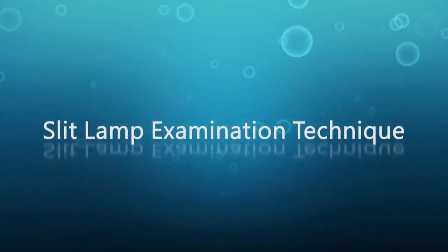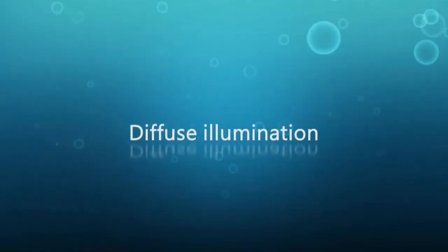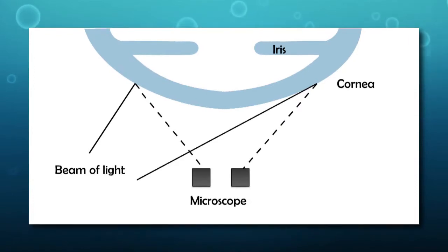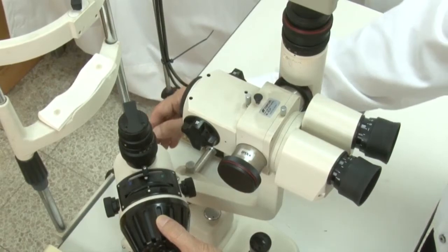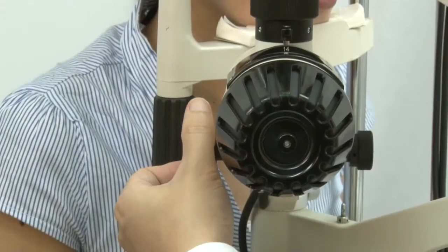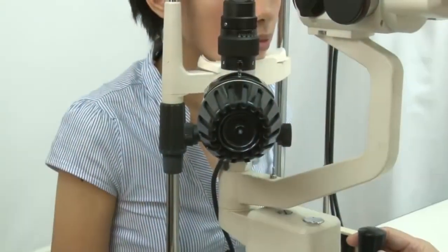Slit lamp examination techniques can be divided into three categories according to the type of illumination. The first type is diffuse illumination, formed by using a wide slit beam. First, set the light source and microscope separated by 45 to 60 degrees. Then set the light source as a wide slit beam at the lowest intensity. Begin with low magnification. If any unusual condition is observed, gradually increase the magnification for more detailed examination.